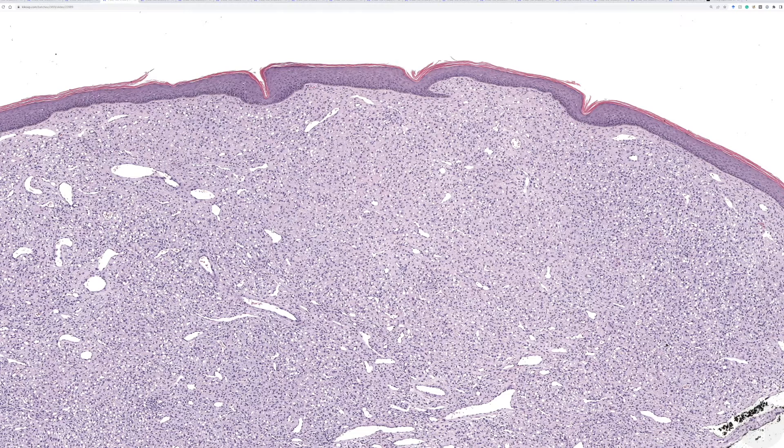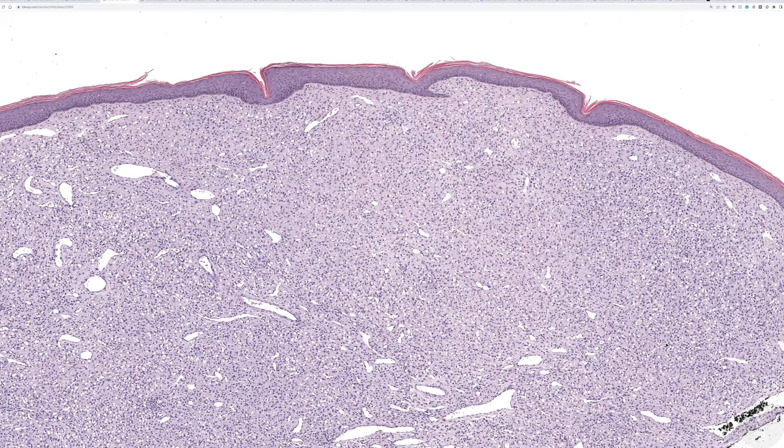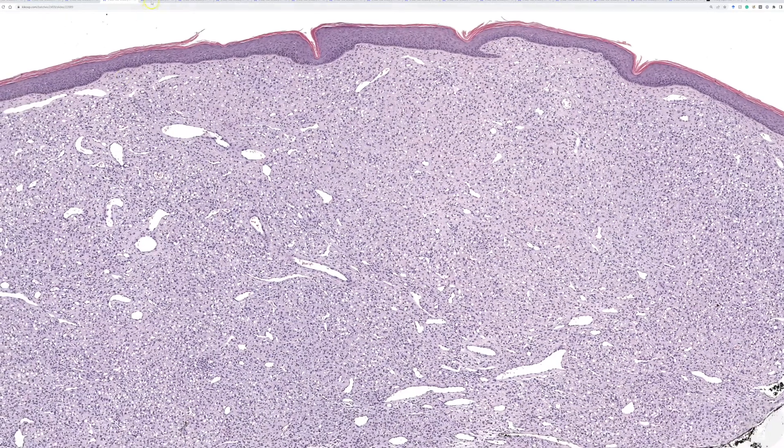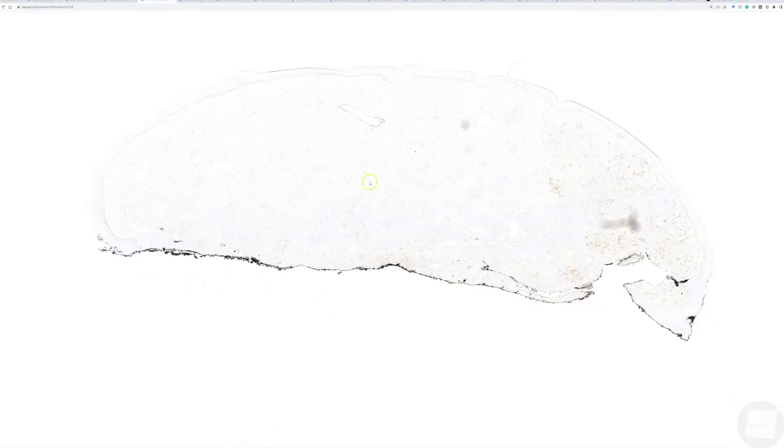ALK1 is positive in the majority, about 90% almost, of cases of this entity. And here, we did ALK, and ALK is positive.